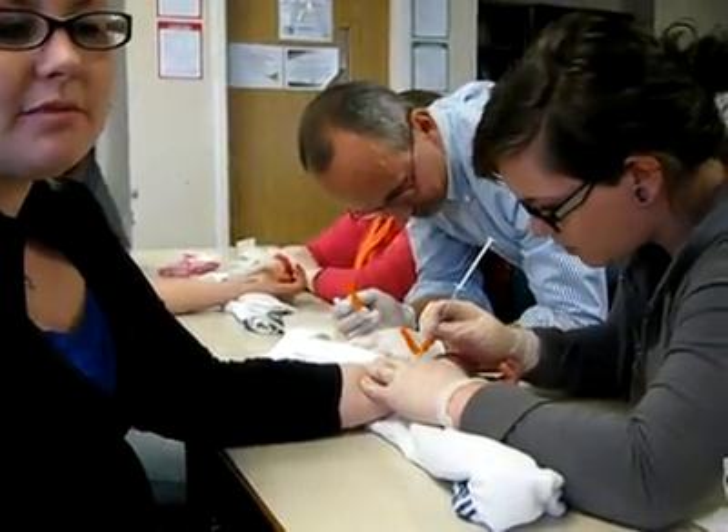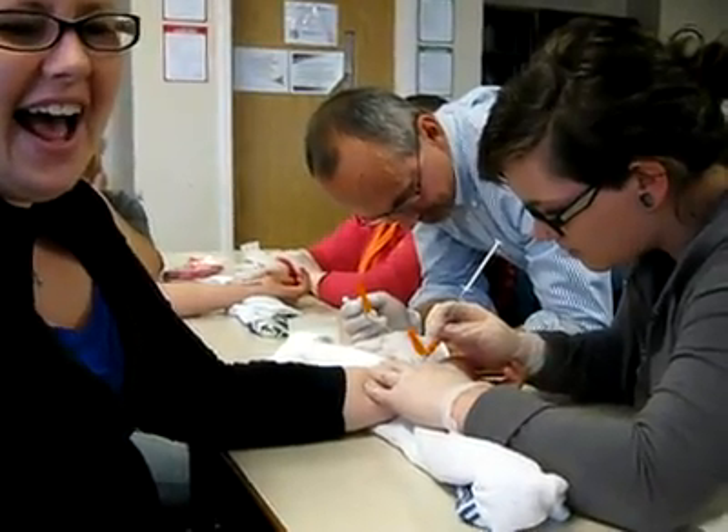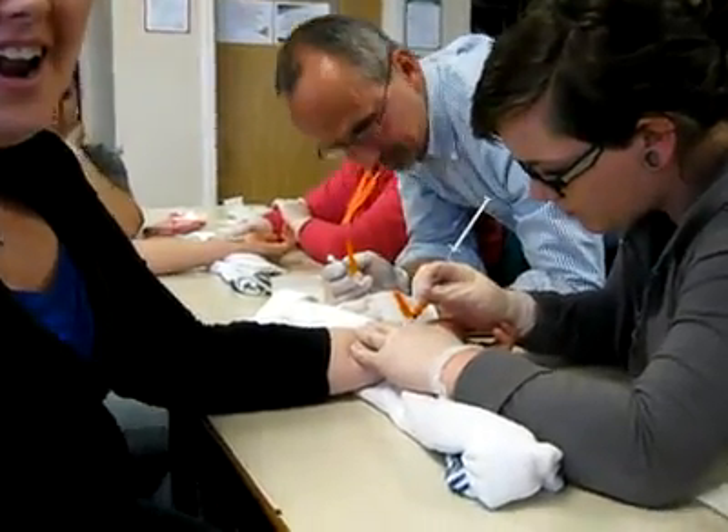You got it. You got it. It's good. Stay there, stay there, stay there. Move forward a tiny bit. She's got blood. Stay right there. Good job, Tess. You're doing good.